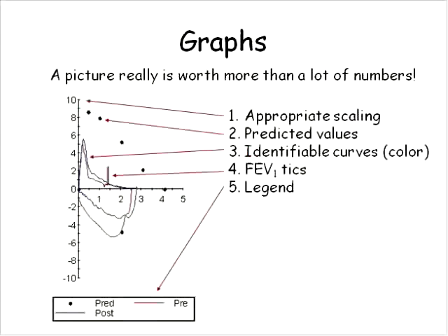Most of the time, we can also report graphics as part of our report, and I would submit to you that perhaps the graphics might be the most important aspect of the report, because a picture of what the patient's physiology looks like may be an easier way to digest what's going on than a lot of numbers like you saw on the previous slide. Some of the key ingredients that should be included in the graphics are exemplified here. Number one, appropriate scaling is probably the most important.